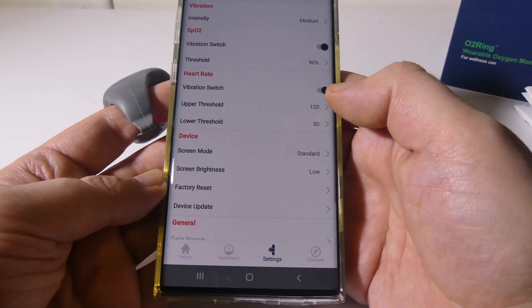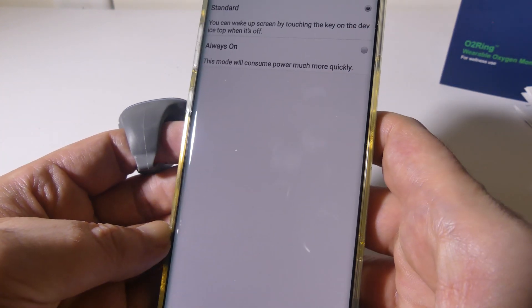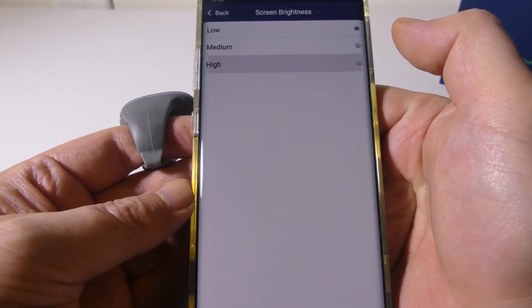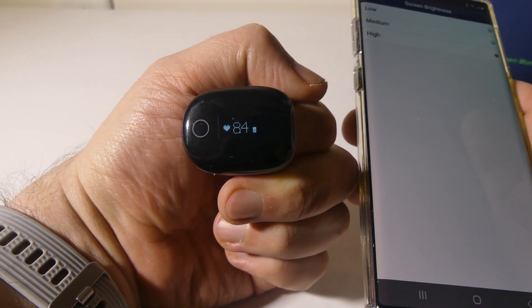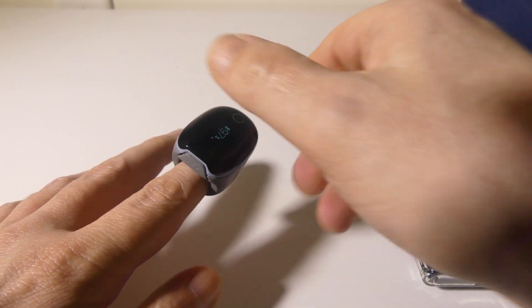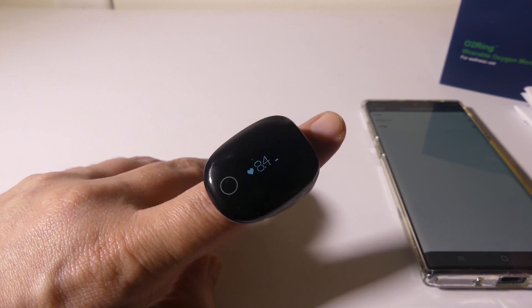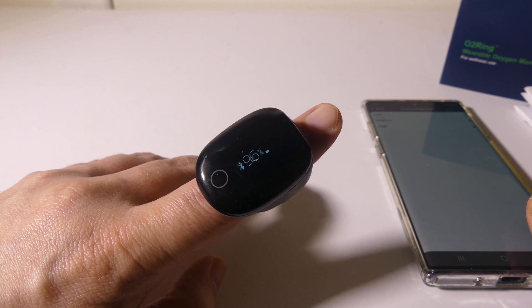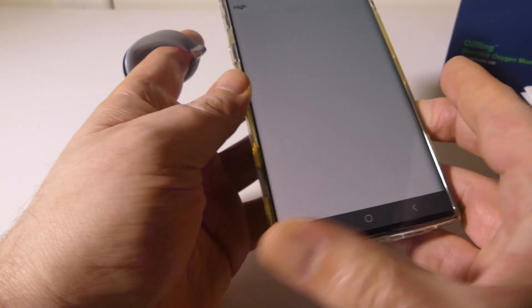There's a screen mode and screen brightness setting. In standard mode, the screen turns off in about 10 seconds and you can touch it to turn it back on, or you can set it to always on. I bumped my brightness from low to high — it's quite bright, so you may not want that setting at night. The low setting at night is great. Right now it's showing 84 beats per minute and 97% O2 saturation, which is good — my heart rate's slightly elevated from talking and doing the review.